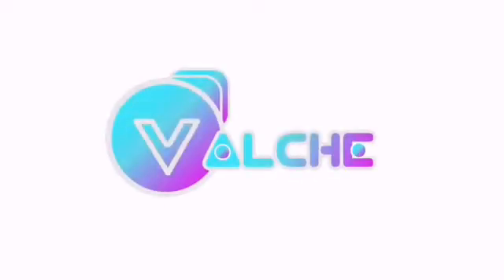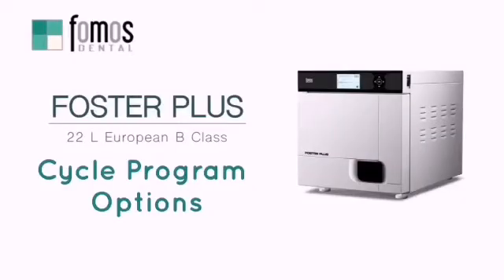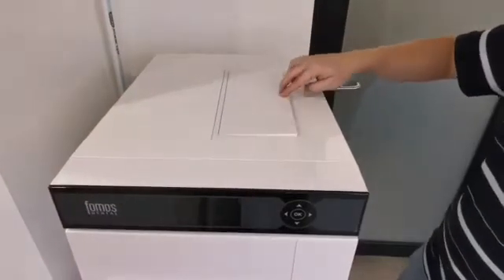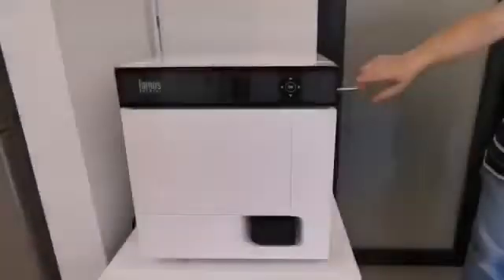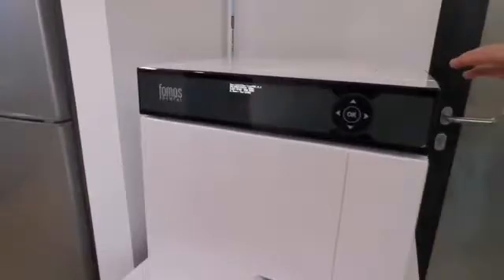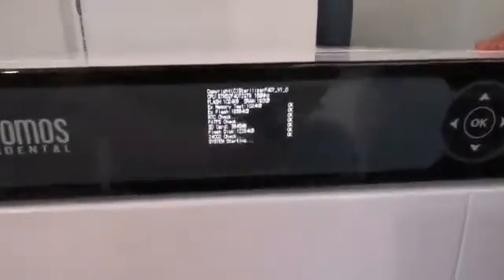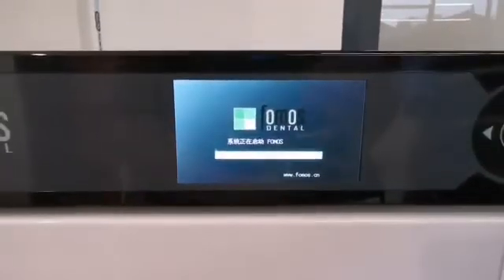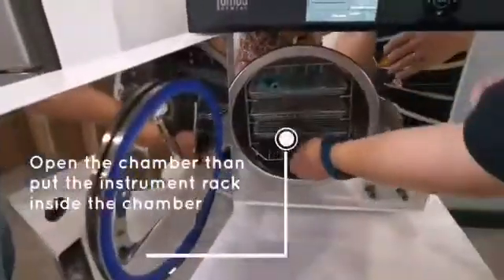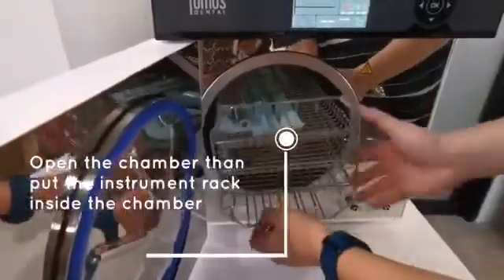Valche Dental presents the Foster Plus Cycle Program System. Put distilled water in the tank. Switch on the power button — the unit will enter into self-test mode directly. Open the chamber, then put the instrument rack inside the chamber.